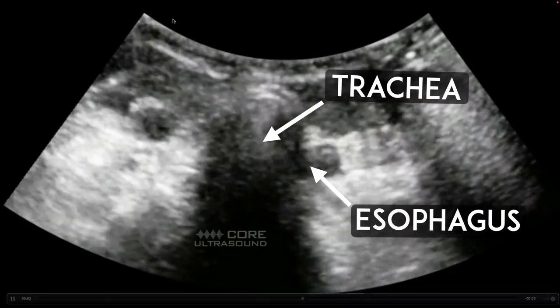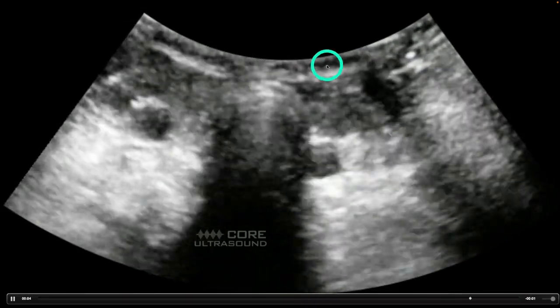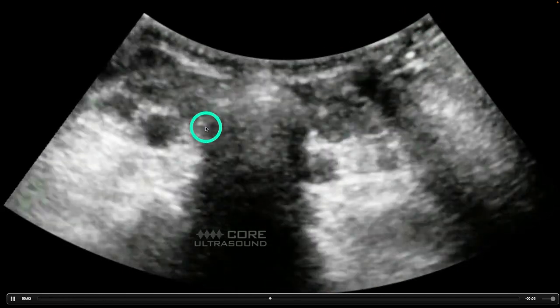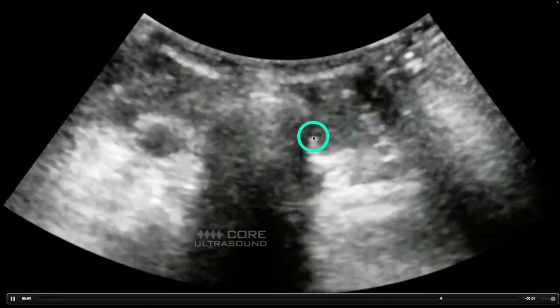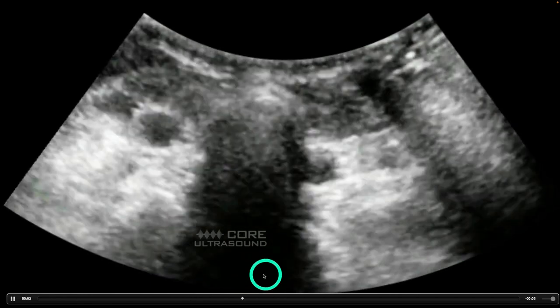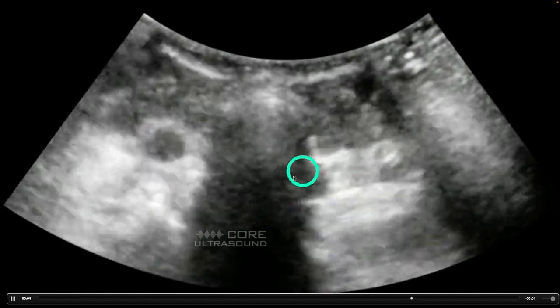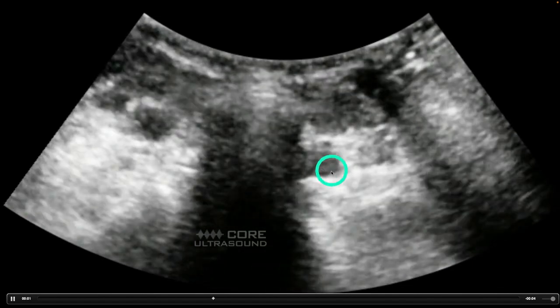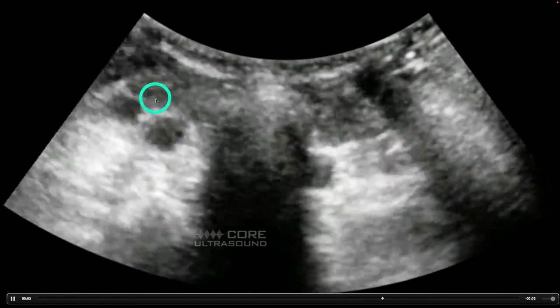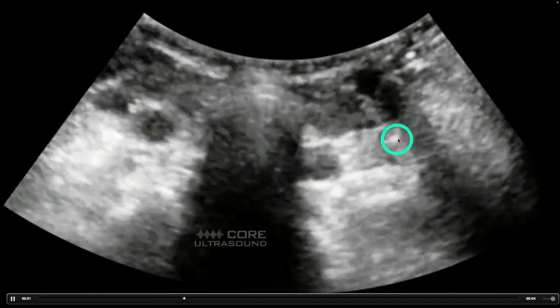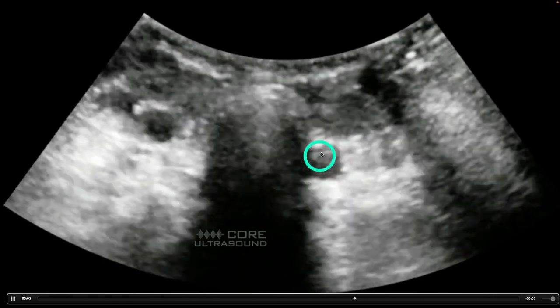Right here we have the trachea and right there we have the esophagus. Looking at this with the curvilinear transducer, we're seeing a hyperechoic arch which represents the anterior part of the trachea. Then we're seeing dropout of shadow - this acoustic shadowing - which happens deep to the trachea due to the air in the trachea. And right here we're seeing a circular structure with relatively well-defined walls, which represents the esophagus. We have some vasculature here and thyroid tissue, but the things we're looking at are trachea and esophagus.